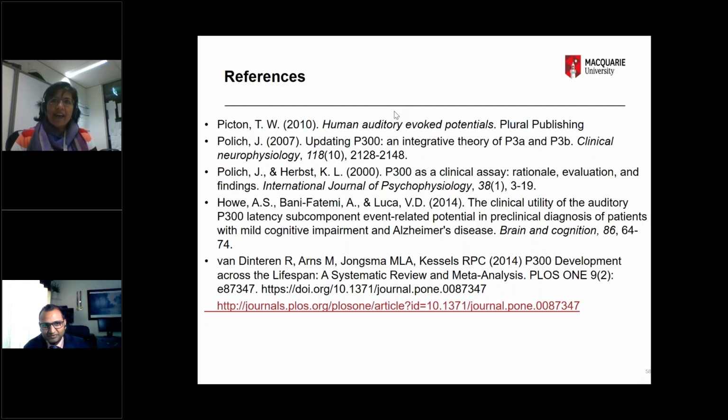But what I was pointing out was that if we wanted more, P300 is able to give us a finer difference in the spatial segregation aspect. So why not try that? But by no means would that be ready for diagnosis the way LiSN has been tested and trialed. So not there yet, but certainly 90 degrees is a massive difference. If kids can't do that 90 degrees, they certainly won't be able to do the 30 degrees.